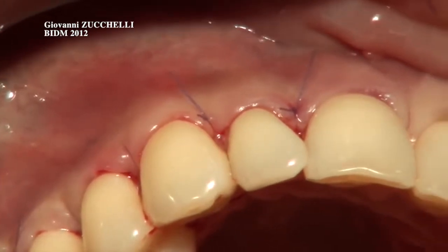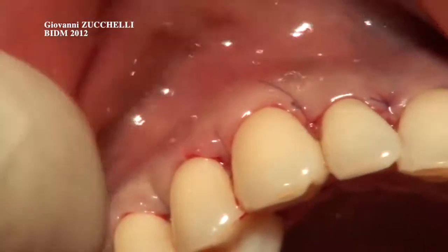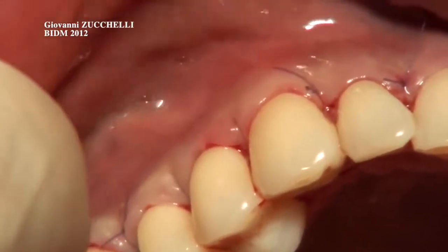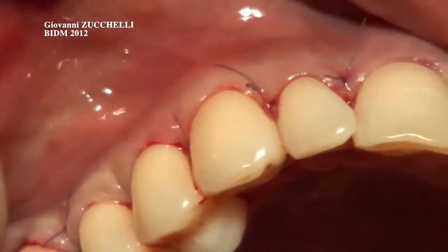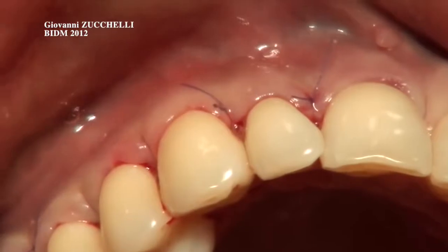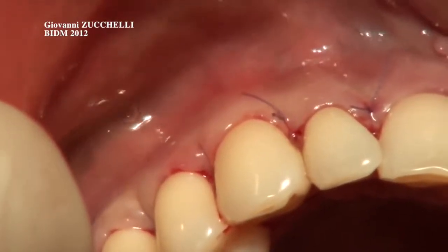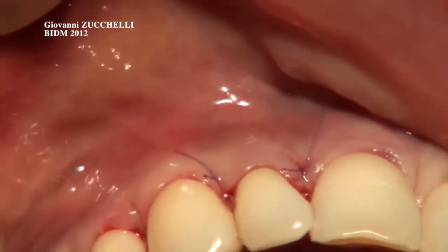You see that everything is stable. Even if I move the lip, the marginal tissue stays there. The marginal keratinized tissue does not move, and this is because I completely separated my alveolar mucosa from the depth, that is the periosteum, and from the superficial aspect, that is muscles. When you move the alveolar mucosa, the keratinized tissue above the convexity of the crown must not move. This means giving stability to your coronal advanced flap and rendering the healing of the coronal advanced flap independent of the patient's movement of the lip.